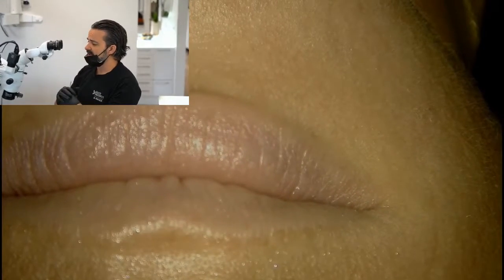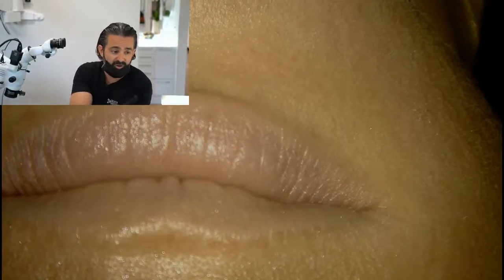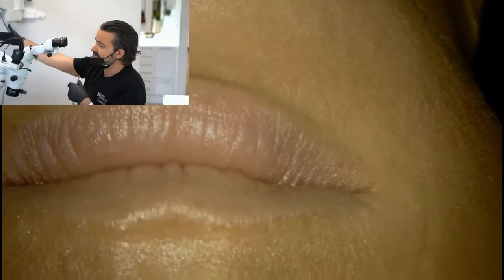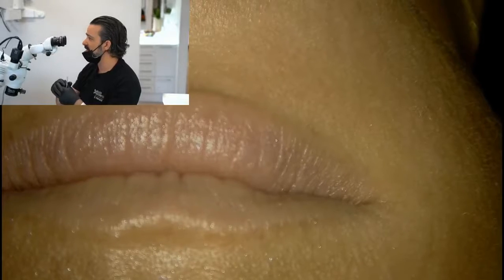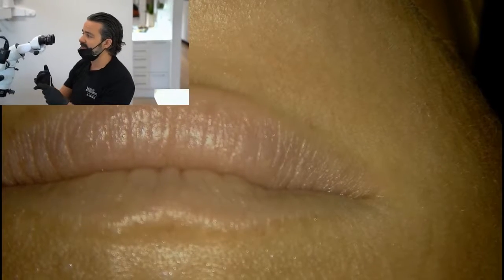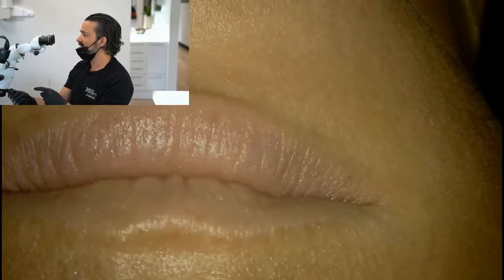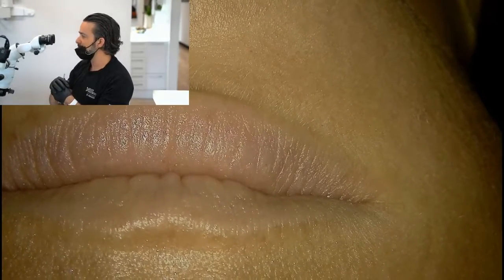On a microscope, that image is always that image, even when I'm looking around or talking to my assistant or to a companion in the room from the patient. Maybe it's a patient's mom or something. And if I'm doing video documentation or image capturing, or I'm wanting to explain something to mom or dad, it's really nice having this in a static position.